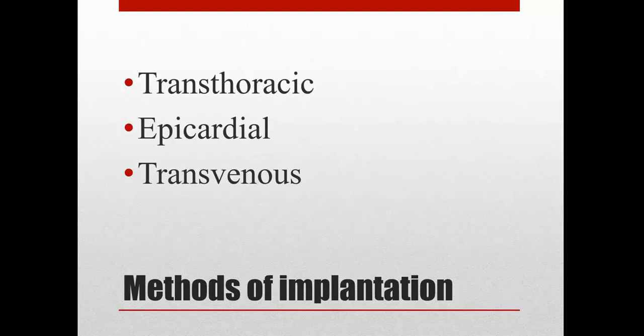Let me go back. So implanted permanent pacer generators are planted just under the skin, as I mentioned before. And a lot of the places they can be seen, usually right under that collarbone.